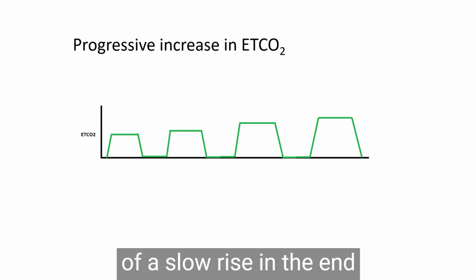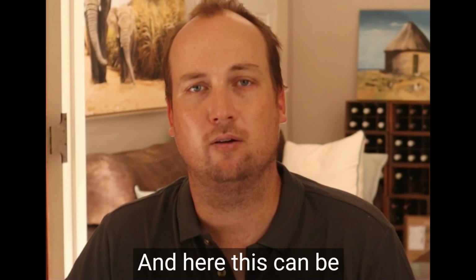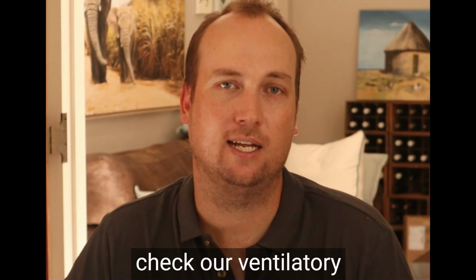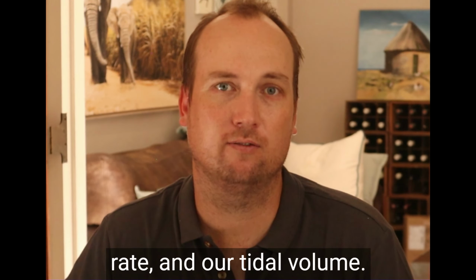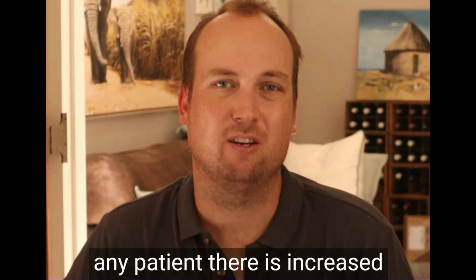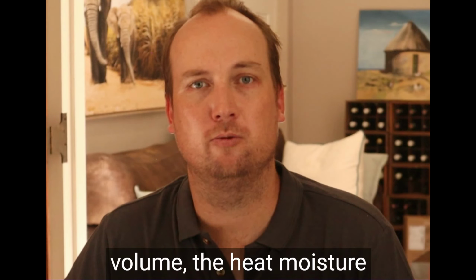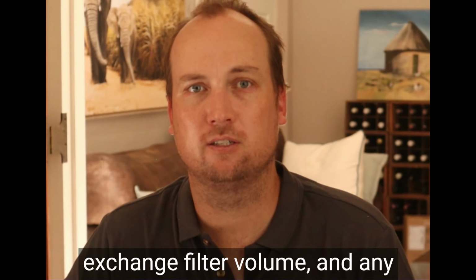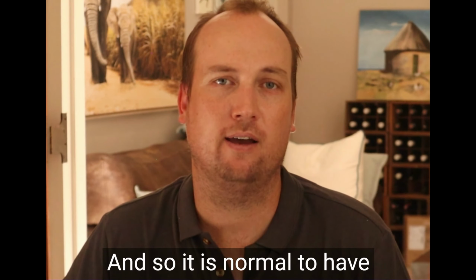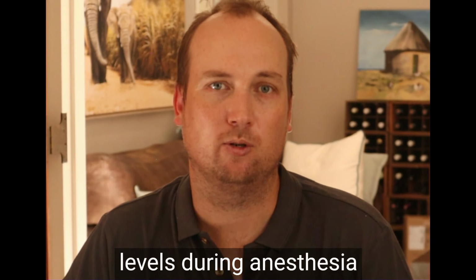The next pattern is that of a slow rise in the end-tidal carbon dioxide levels. And here, this can be caused by hypoventilation. And again, we need to check our ventilatory parameters, our respiratory rate, and our tidal volume. And it's important to remember that when we're ventilating any patient, there is increased dead space ventilation because of the endotracheal tube volume, the heat moisture exchange filter volume, and any extension up to the Y connector. And so it is normal to have slightly higher carbon dioxide levels during anesthesia because of this fact.